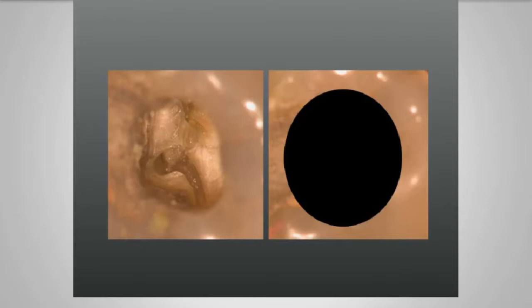We're looking down those root canals. You can see little calcifications here within the root canals. And here you can see a little calcification, a little ball of dentine that's just about to drop down that palatal root. So magnification and illumination essential.